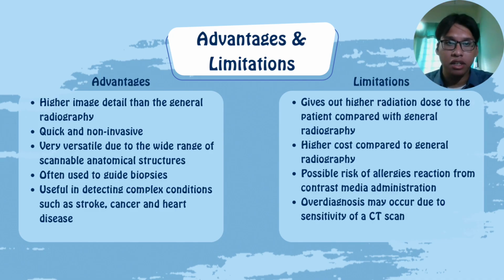Next, because some CT scan procedures require a contrast media, there is a possibility that it would trigger an allergic reaction from the patient when we administer this contrast media. Finally, because of the oversensitive nature of a CT scanner, there might be a possibility of overdiagnosis, which sounds good, but imagine you came to the imaging department just to check why you have had a stomachache for the past week, and then suddenly the doctor finds out that you actually have cancer or something like that, which will of course terrify a patient.